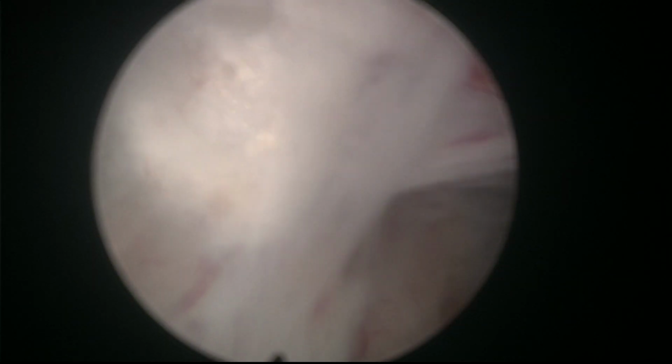But of course, when I started using holmium and looking at the excellent, careful, gentle dissection that you can have with holmium, I switched from mechanical enucleation to energy driven. Of course, sometimes you don't know exactly where the proper plane is, but more and more, with experience, you are quite certain of where you are and quite happy recognizing the proper plane and not needing to do mechanical enucleation.